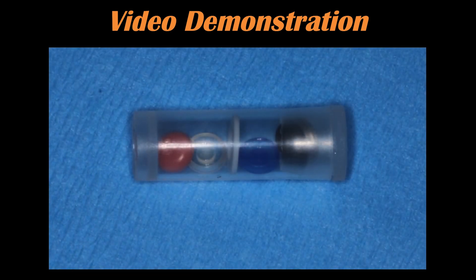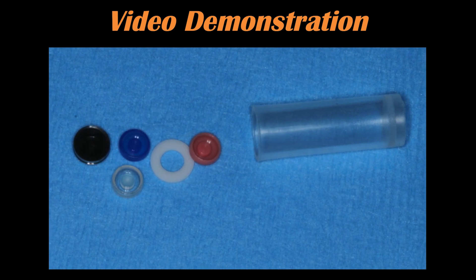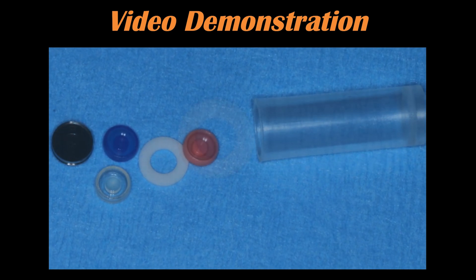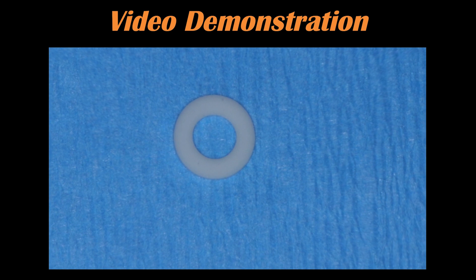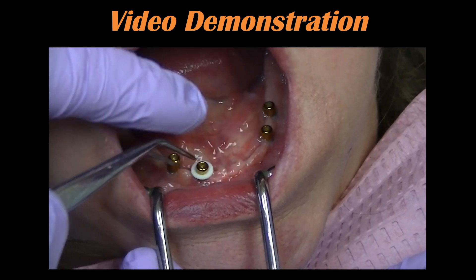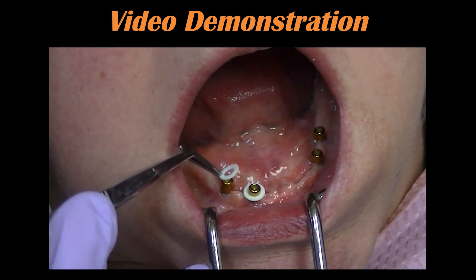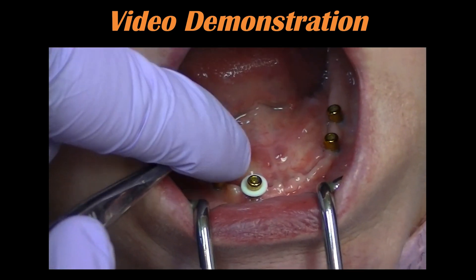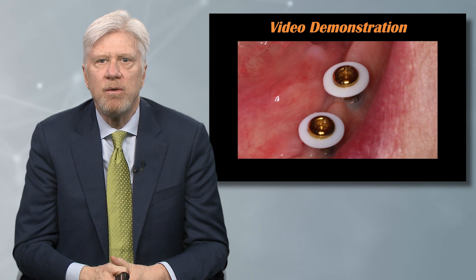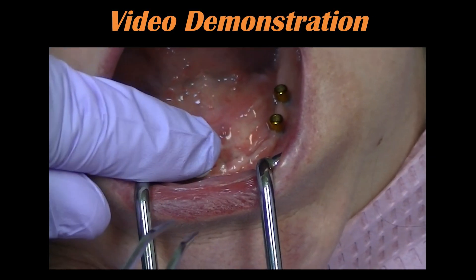These are processed dentures. Here's our locator system — you'll get all the attachments with the spacer ring, the housing, the titanium housing, and the black processing male. We take that O-ring over each of those locator abutments; they just slip right on and are clearly blocking out undercuts. Here's our titanium housing — we snap those on and they simply snap into position.